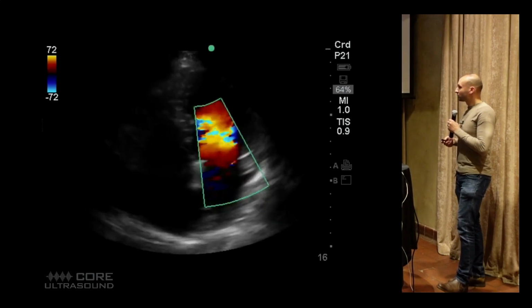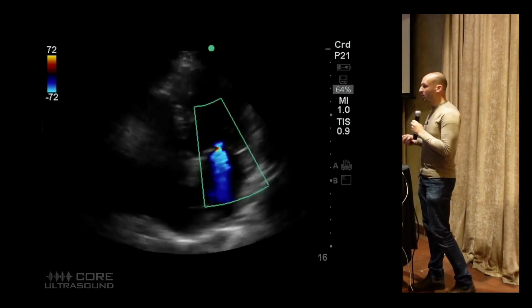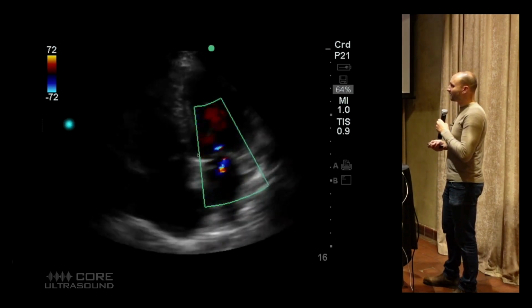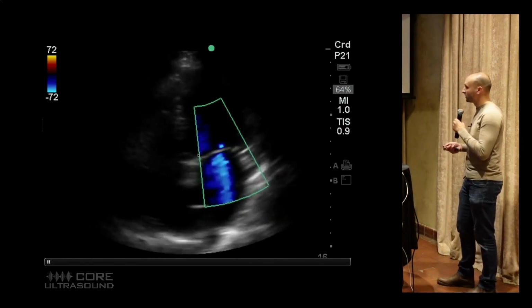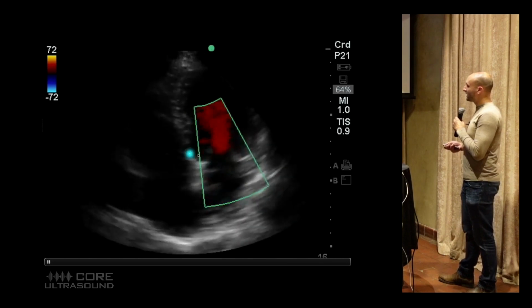Lastly, we're going to talk about regurg. It's pretty easy. You just throw color flow on there and you just see if flow is going the wrong direction. Now this right here, I usually edit all the extra stuff out, but I'm going to leave these in here for the evaluation of regurgitation, because all you want to know is, is the blood moving in the wrong direction? And the way you know that is by looking at this.